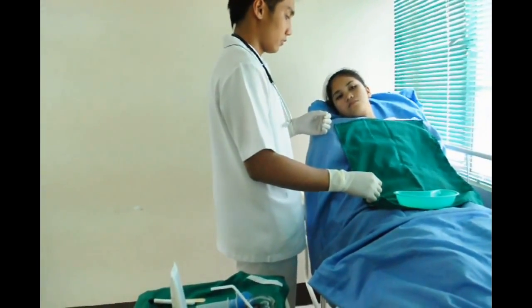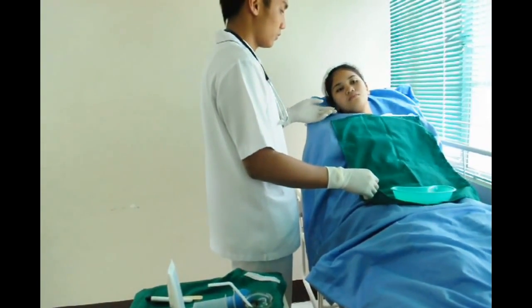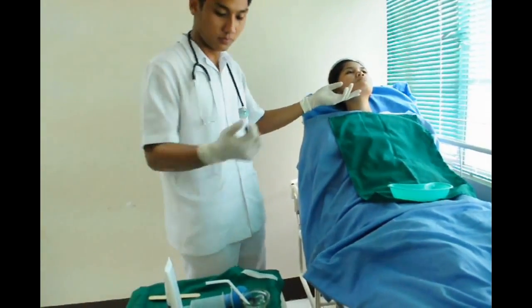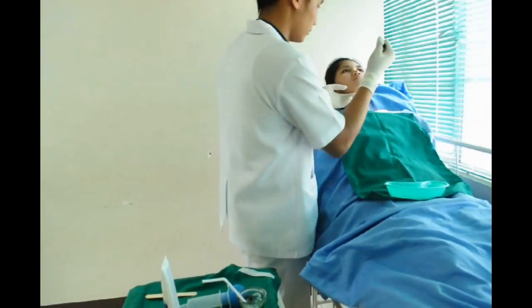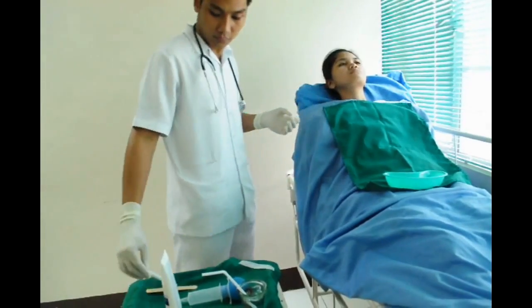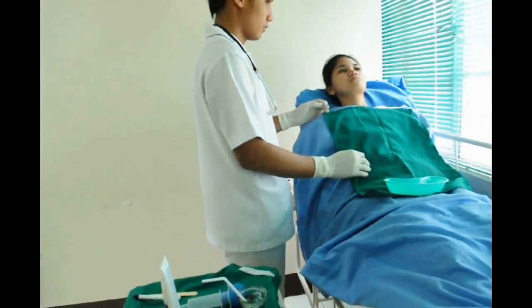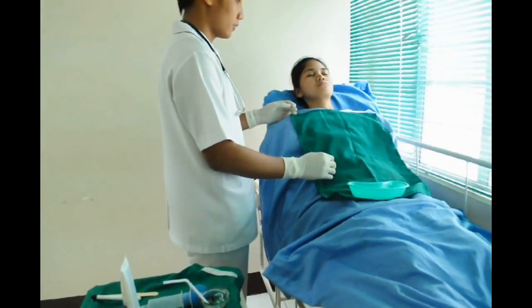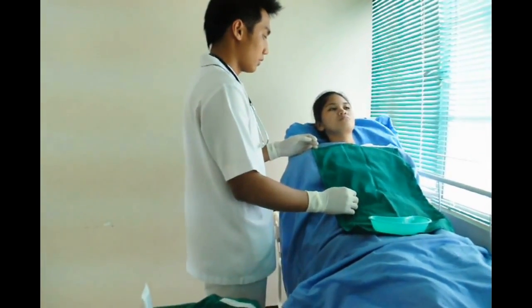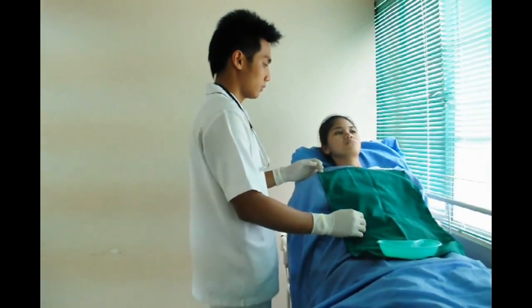Assess the client's nares. Ask the client to hyperextend his head. Using a penlight, observe the intactness of the tissues of the nostrils. Assessing the nares to be inserted with a tube can prevent further trauma. Examine the nares for any obstruction by asking the client to breathe through one nostril while occluding the other, and also ask about past surgery, polyps and trauma. Select the nostril that has greater airflow.